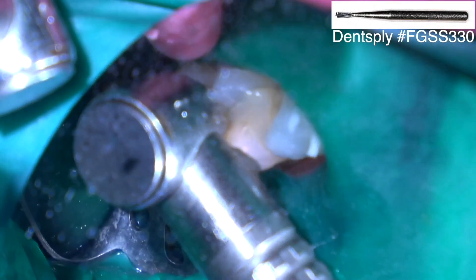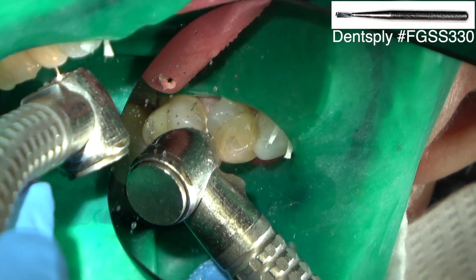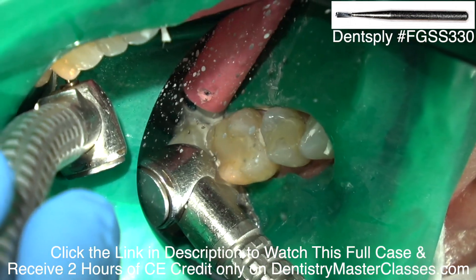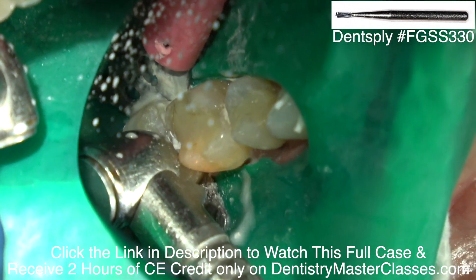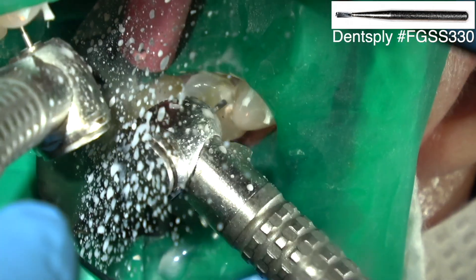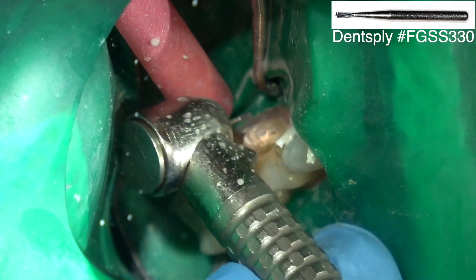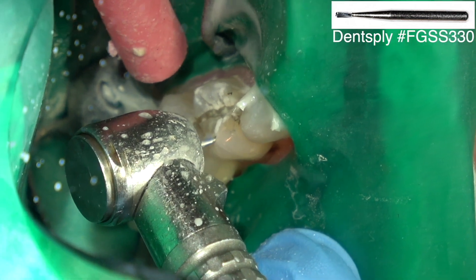Now we're going to prep the other side. This bicuspid had a large interproximal composite, so we're going to place a crown on the bicuspid. I'm cutting interproximally with the 330 carbide burr, not touching the adjacent tooth. Then I'll cut my depth cuts into the bicuspid with the 330 — the cutting part is two millimeters, which is exactly the depth I want for the occlusal reduction. I like to reduce two millimeters so the technician has plenty of room for the occlusal aspect of the restoration.